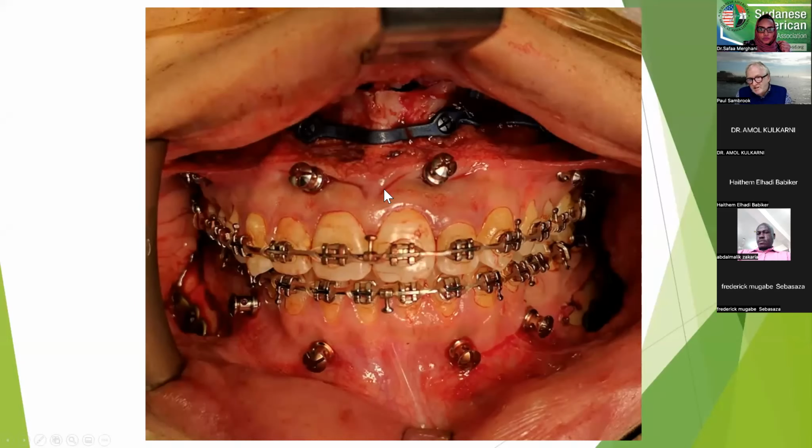As I said, as time has gone by over the last few years, I have gone back to a final wafer, and I will do my sagittal split osteotomy freehand and use a final wafer and intermaxillary fixation to determine the position of the sagittal split. I think that is far more effective in my hands than it is a cutting guide and a positioning plate.